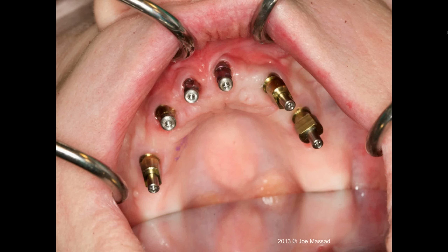You will have to cut multiple holes, and generally those multiple holes will become just one big hole, and now you don't have stability of the tray. In this particular case, we used 3 closed impression copings, and on the posterior we used 2 open on one side and 1 open on the opposite side. So this is going to actually give us a much more stable tray.